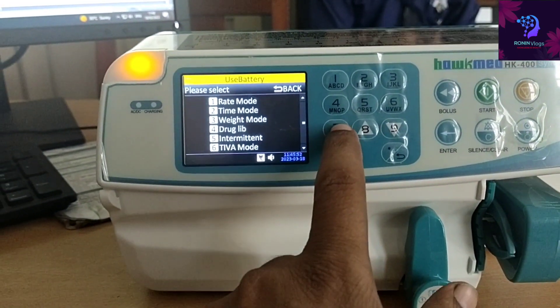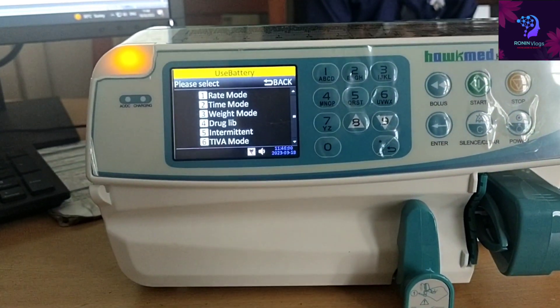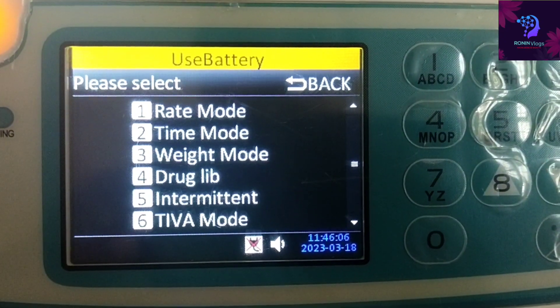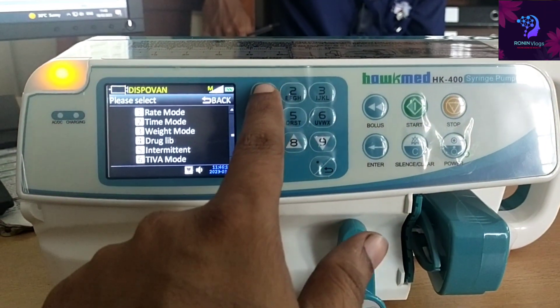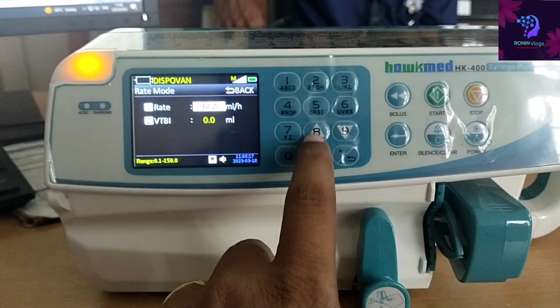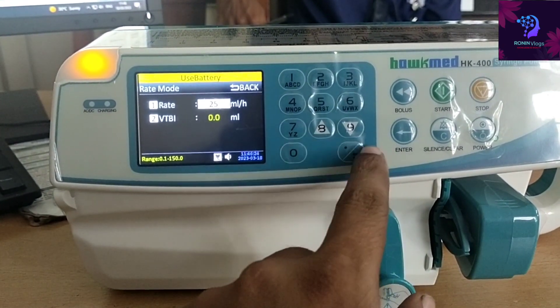To edit the rate, press the number button again and you can easily edit the values. To go back, just press the return back button. The machine is currently on battery backup, so it will indicate that. When you switch it on, it will automatically come to the selected mode.